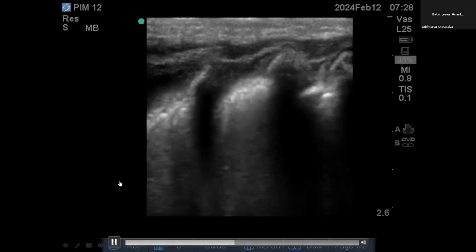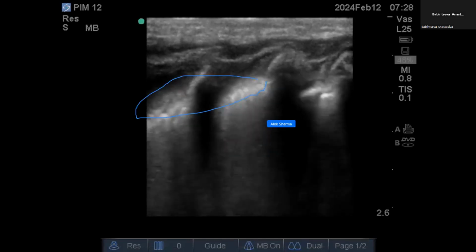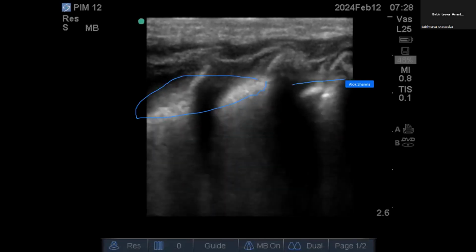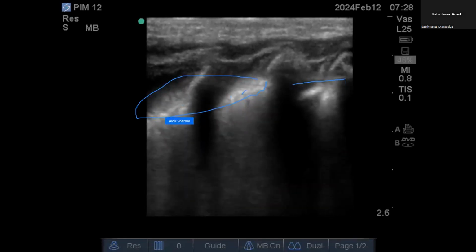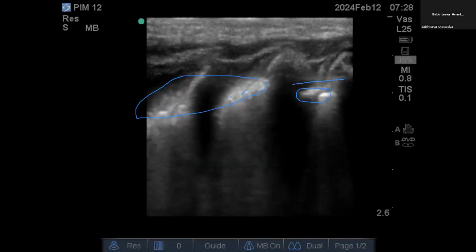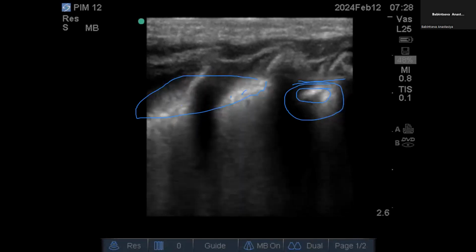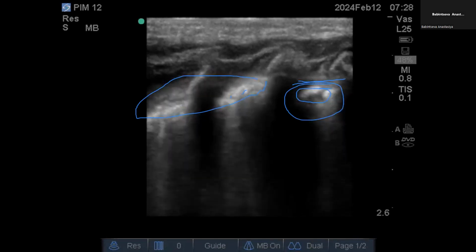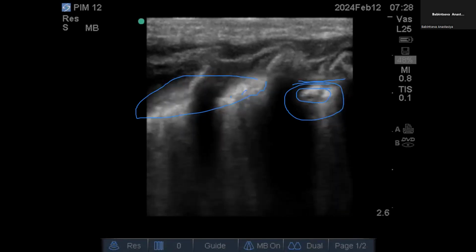The pleura is definitely visible here. It's thick and blurred. Where it's not visible is here. What you've got are these subpleural consolidations over here that you can see very nicely. Here you've got deeper consolidations, but the pleura is not established because the lung is not aerated. So here you've probably got a little more atelectasis. If you zoom out and go to about 3.5 to 4 centimeters, you will be able to see this a little better. My only comment is your depth should go up to a minimum of 3.5, considering it's a 32-weeker.